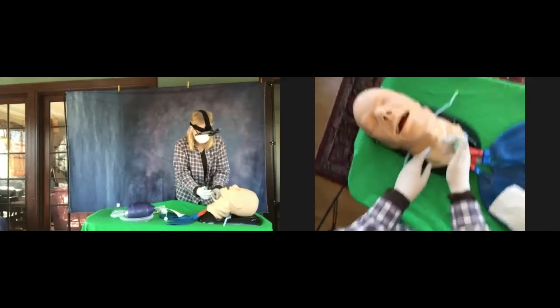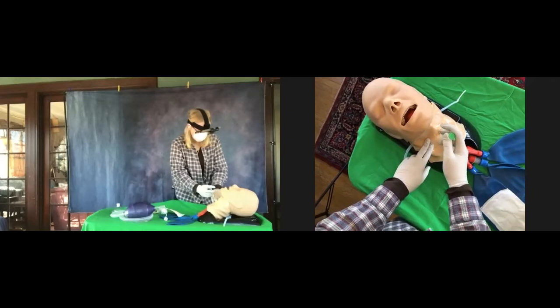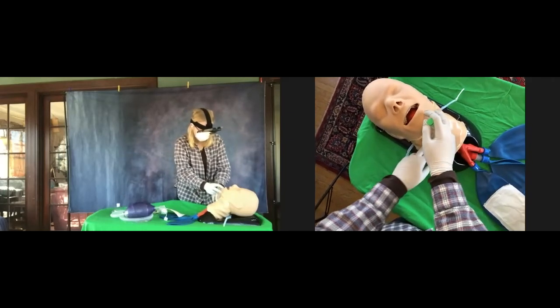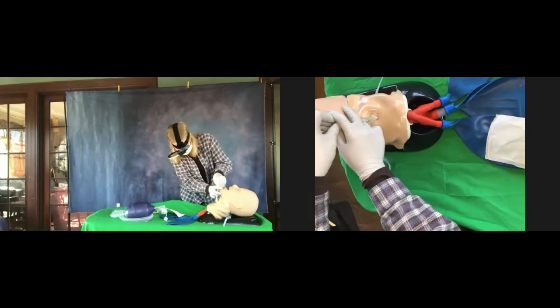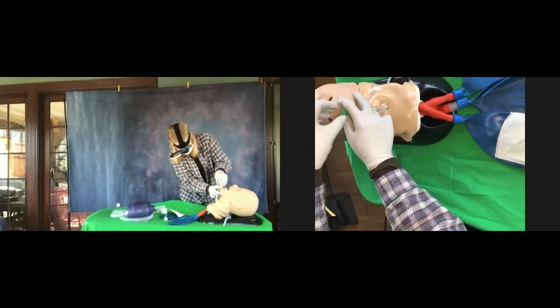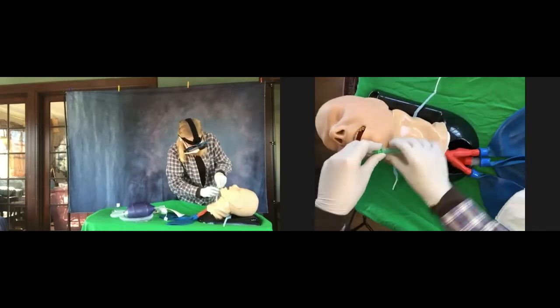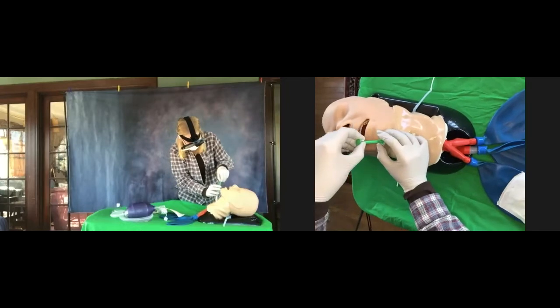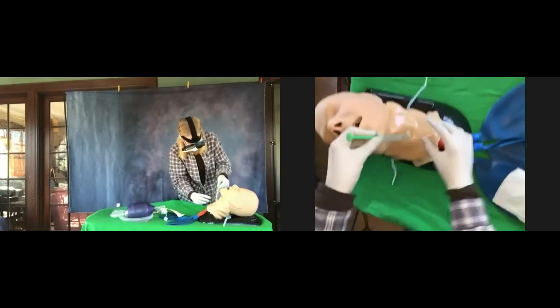Is it in? Yeah. There you go. Now tilt it again 45 degrees towards the patient's head and advance it until the stopper is at the skin level. Is the stopper at the skin now? Yes. Go ahead and aspirate — make sure you get air back. Good. Now remove the stopper. Don't push it down, just remove the stopper.